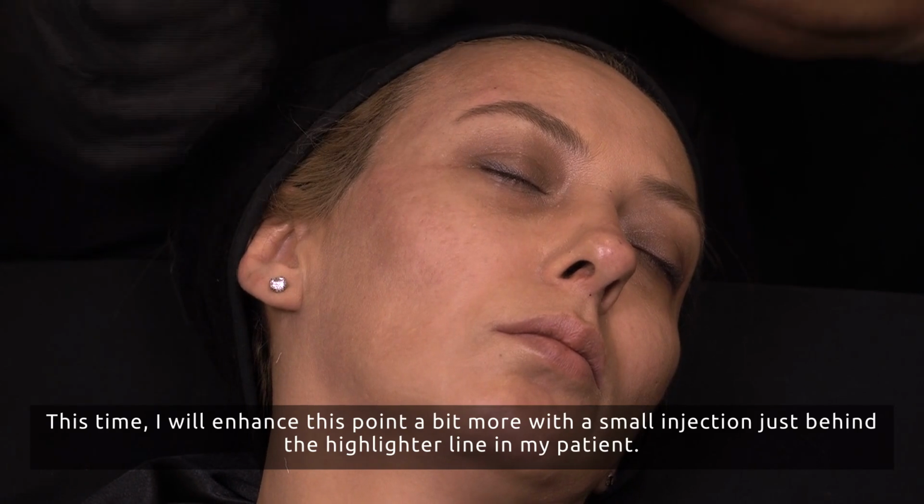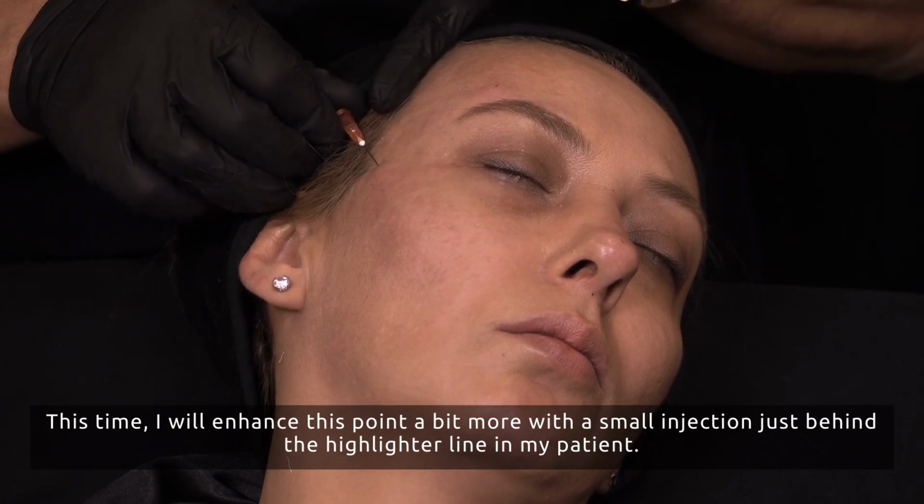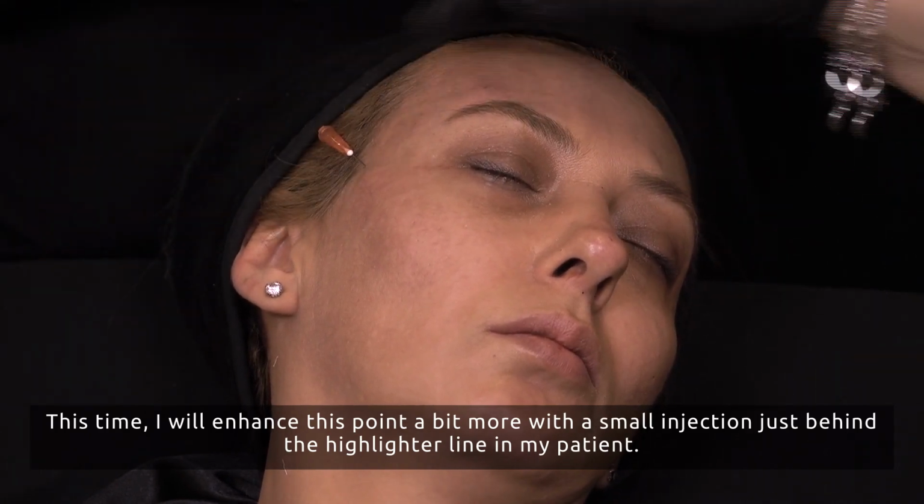Guiding the needle again. This time I will enhance this point a bit more with a small injection just behind the highlighter line in my patient.